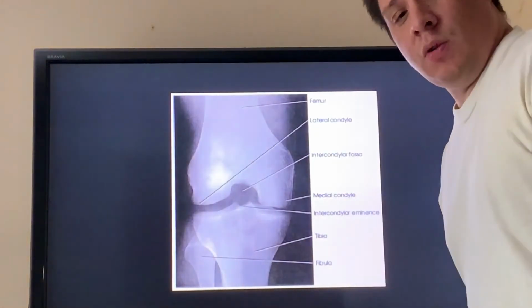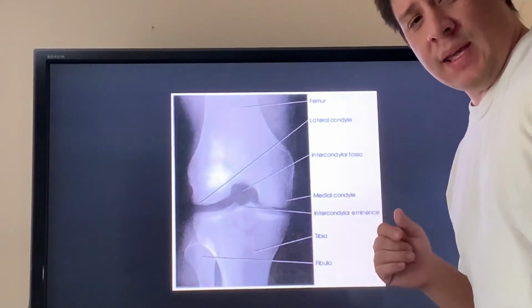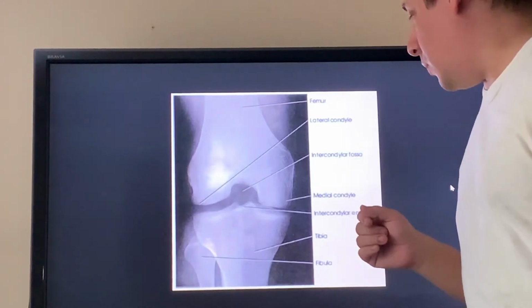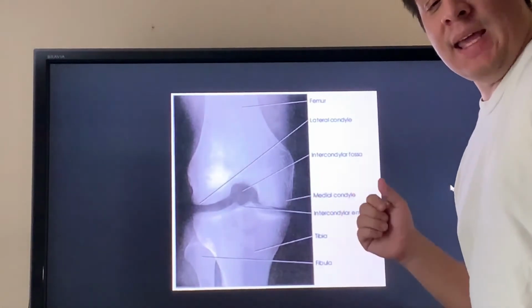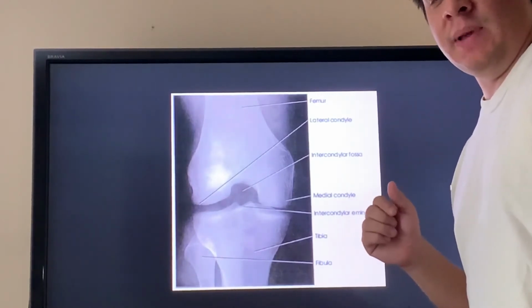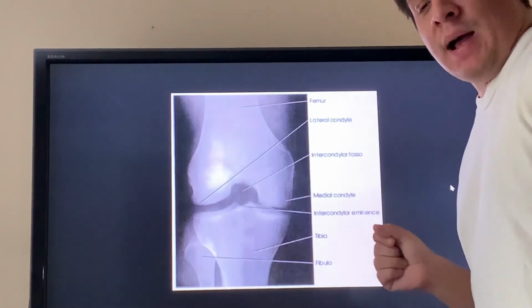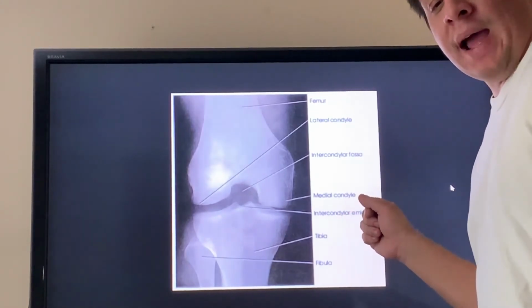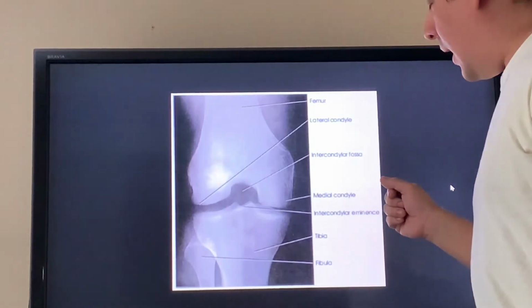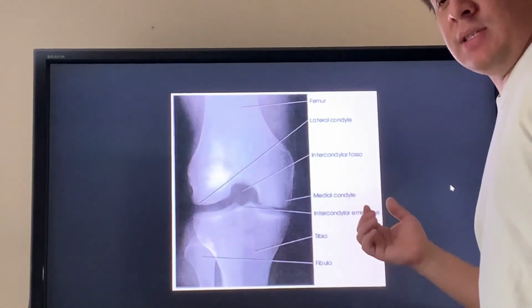Okay, this is Alejandro performing the last x-rays for the knee trigger. We're going to be looking at the next image, which right here is going to be the AP axial projection of the intercondylar fossa using the Beclere method. Now the central ray is going to be focused about half an inch inferior to the apex of the patella, and the knee is going to be bent about 60 degrees.